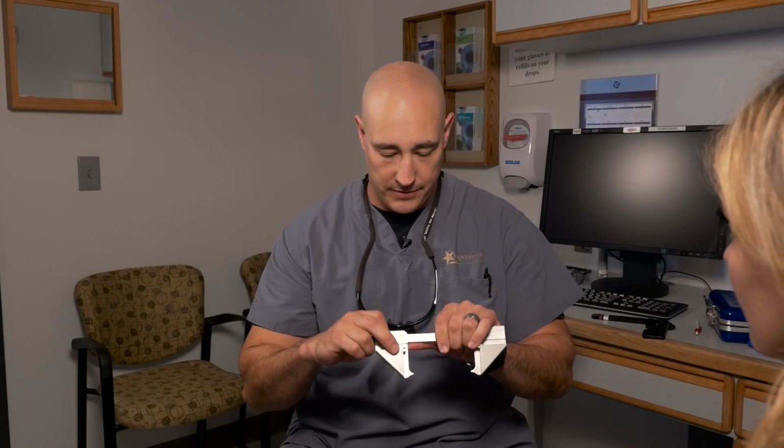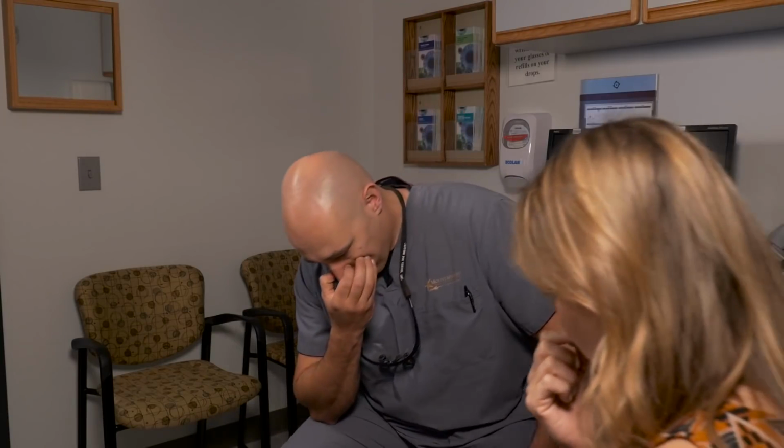All right, and now we want to check the exophthalmometer post-Valsalva. So you want to set your base back to where it was. Hers was at 101. Okay, Meg, here's what I want you to do. I want you to pinch your nose, and then I'm going to have you lean forward and pretend like you're blowing up a balloon or trying to make your ears pop. Basically what I want to do, I want to see your face get red. Okay, so that will mean that we're building up a lot of vascular pressure in your face, okay? So lean over and then blow out and really bear down, use your stomach and everything, so you see her face is turning red. That's perfect.